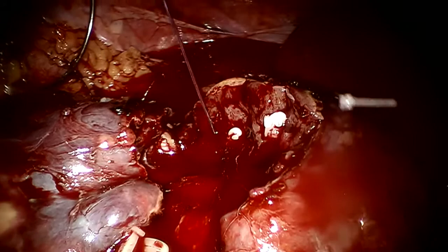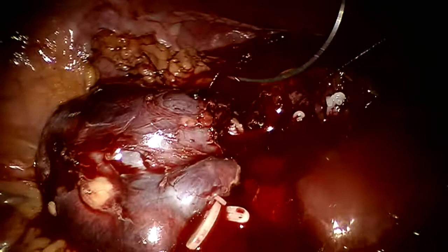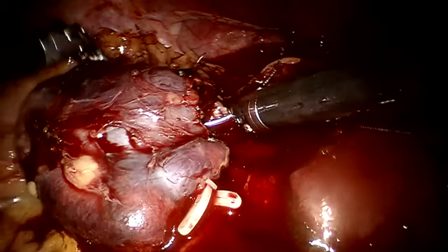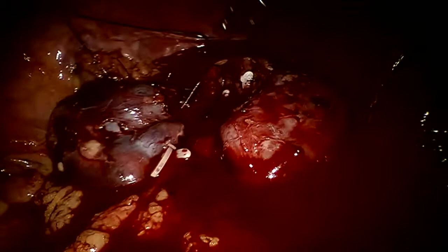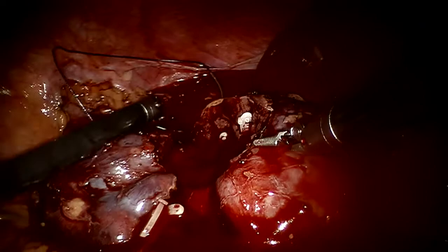And just so that everybody knows, the reason I have not put the tumor in the bag is because we don't have an automatic opening bag. To put it in the bag is going to take me 5 minutes, and I don't want to take those 5 minutes right now. Normally, at home, we would have the tumor in the bag as soon as we cut it out. In this kind of a situation, let's go.